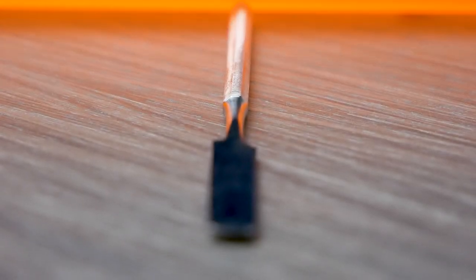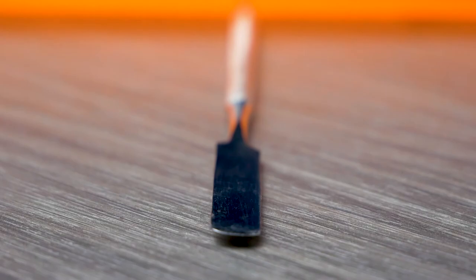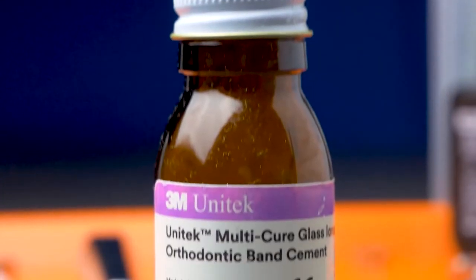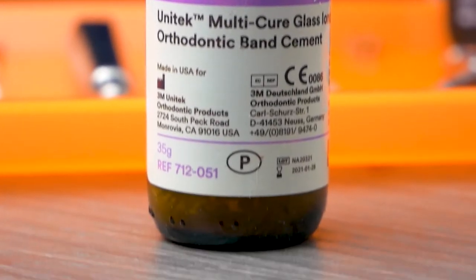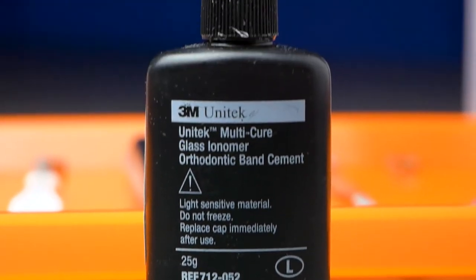The mixing spatula is used to mix the cement that is used to hold the band. This cement is called glass ionomer mixing cement. It is a combination of liquid and powder that is mixed by the doctor. It takes about 15 seconds for the cement to be created.